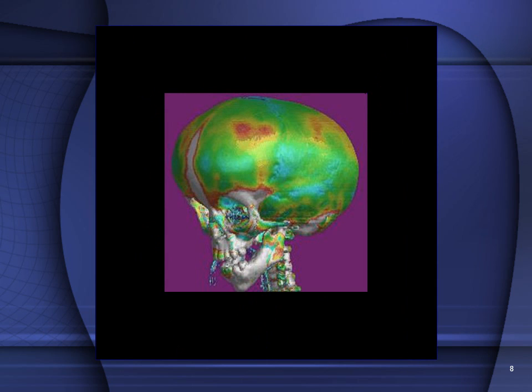And again, this is a type of CT with 3D reconstruction. Do you know what condition is being shown here and whether this is a child or an adult? Think about it for a moment. Okay, this is a reconstruction of a child's skull.